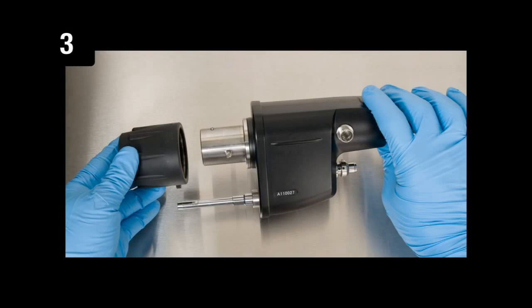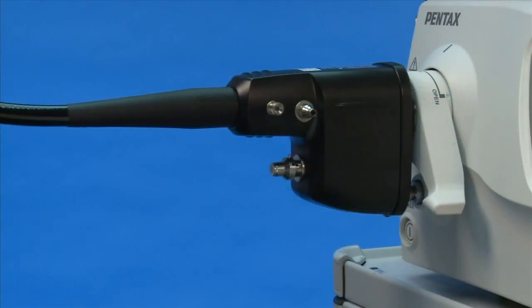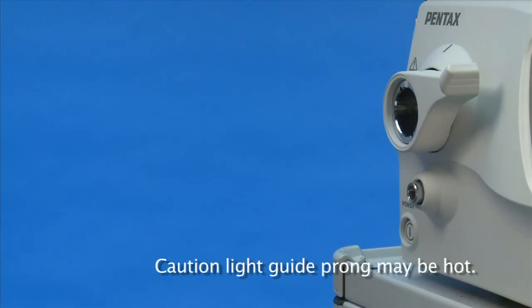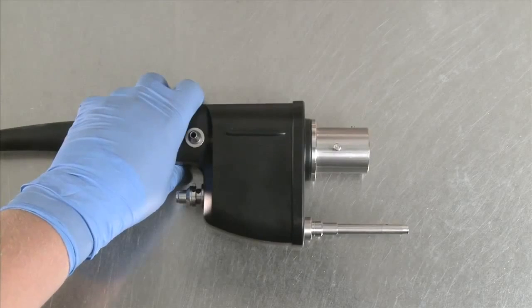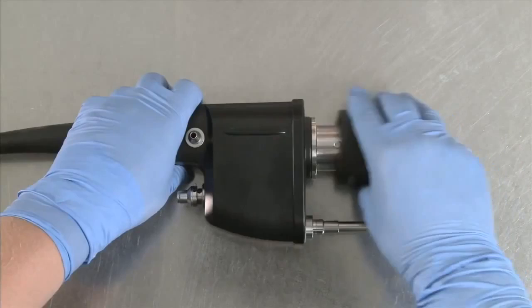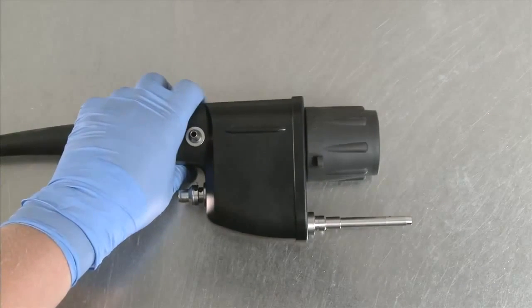Step 3. Attach the soaking cap. Disconnect the suction tube and water bottle tubing from the PVE connector. Remove the endoscope from the processor and attach the appropriate soaking cap. Make sure to align the arrows and lock the cap by quarter-turning it clockwise.